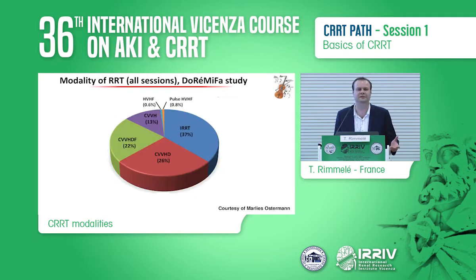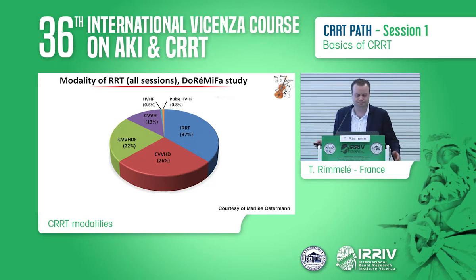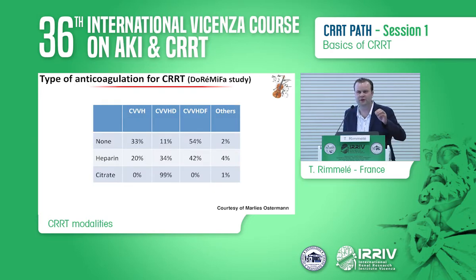When you look at the modalities given to the patients, you have intermittent hemodialysis, and then continuous renal replacement therapy with continuous hemofiltration, continuous hemodiafiltration, continuous hemodialysis. When you look at the anticoagulation given to these patients, you can see the association, like the experts using CVVHD were also the ones using citrate.